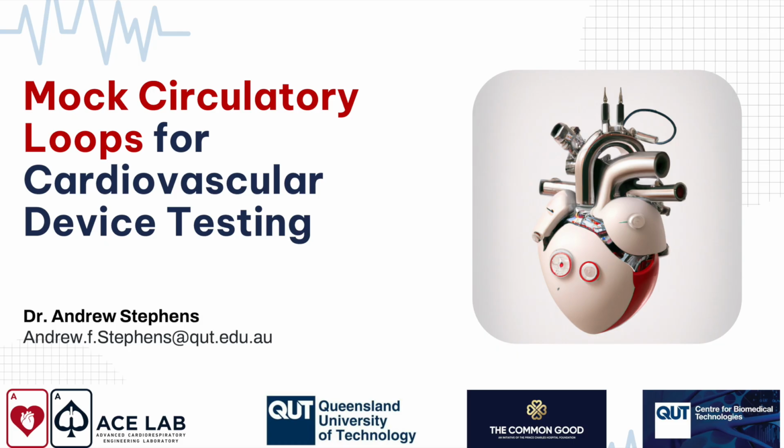It's just like a capacitor in an electric circuit. It only affects the system when there's a change in state. Resistance, yes, definitely you will need resistance, and you'll also, of course, need pulmonary and systemic circulations with different resistance values to be able to simulate the heart, lungs, and body.